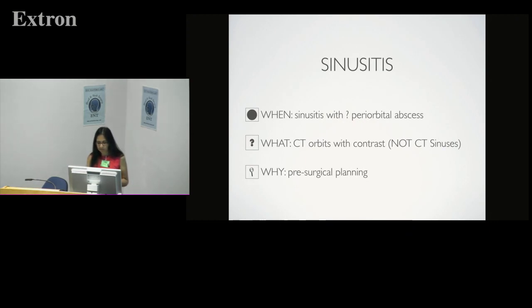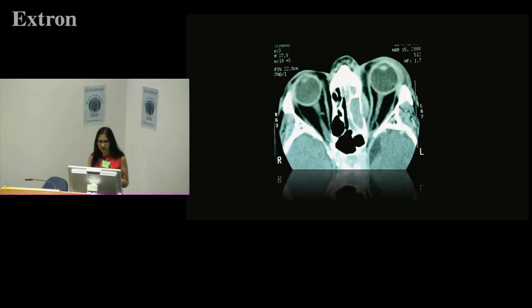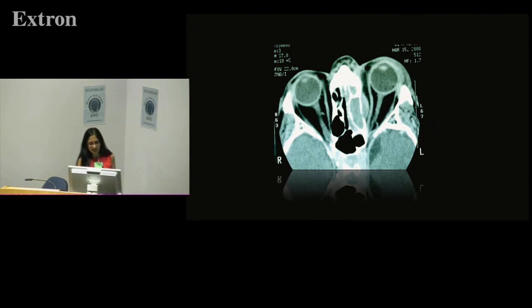When a patient presents with a complication of sinusitis and there are concerns of a periorbital abscess, CT scan with contrast is required for surgical planning. You're looking for whether there is an abscess, whether it is periorbital, and how to approach it. Here is the periorbital abscess alongside sinusitis in the ethmoid sinuses, and this will help you surgically plan for the patient.